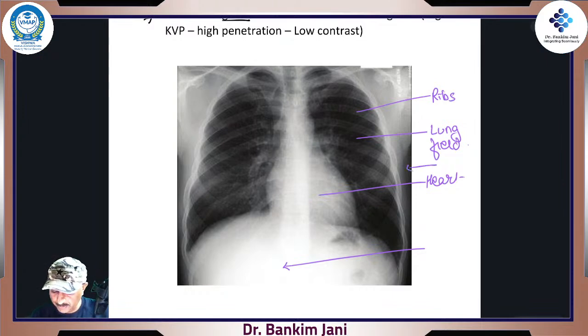Watch for this surrounding part, outside the body, right? It is all black because outside the body it is air. So it goes through and through and it would be generating this picture, right?